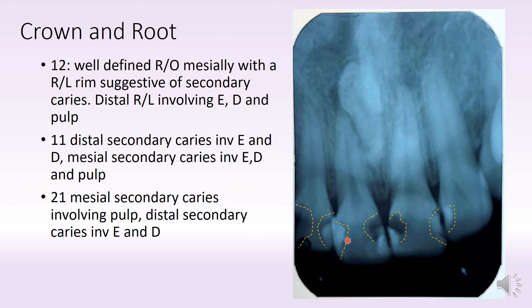You have a radiopacity surrounded by a radiolucent rim. On the mesial surface also we have a similar situation — another secondary caries, again quite deep, which is already involving the center portion of the tooth, which is the pulp.